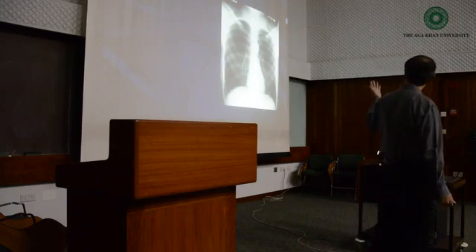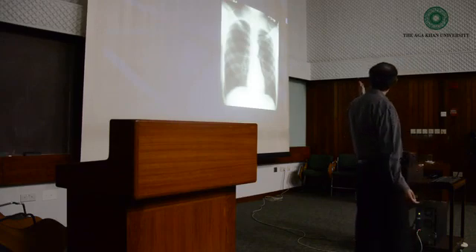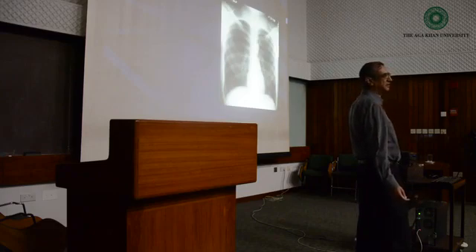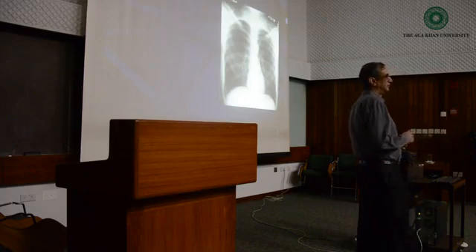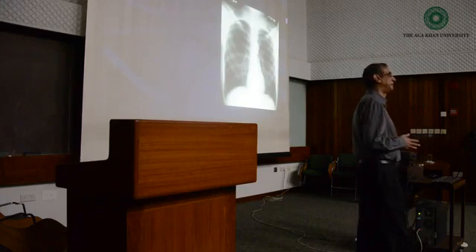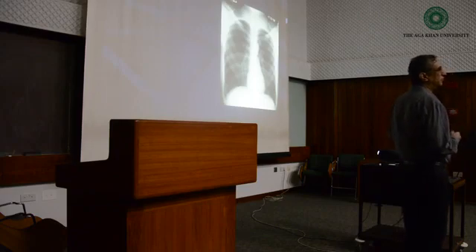One dark black, one grayish. You need one very white and less white. And metal is a fifth density, but it's not in the body normally. An orthopedic fixator, the pacemaker, ECG leads, all these are metals, but they are not part of the body. So the metals are even more effective than the bone in cutting off radiation.